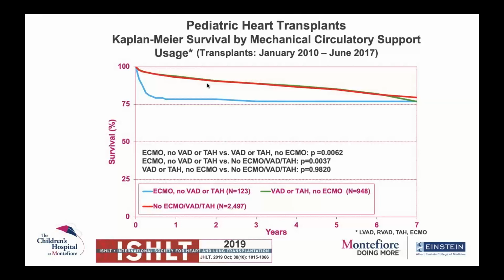The line that is blue are patients who get bridged to transplant using ECMO. As you can imagine, they have significant comorbidities and problems and complications, and they sometimes have worse outcomes than other patients. It's very important to see that getting a VAD is actually not at a disadvantage in the current era.